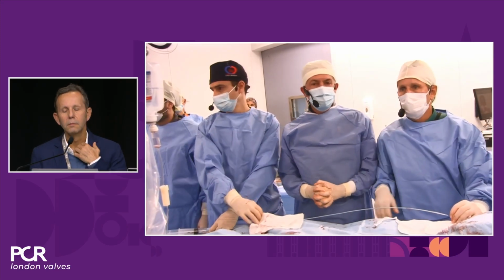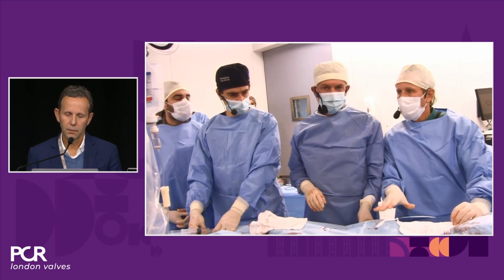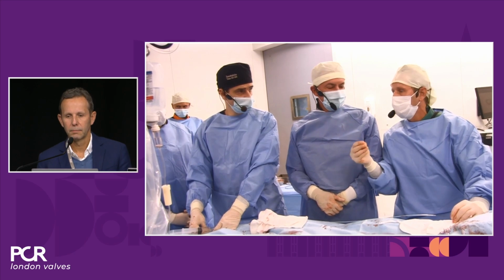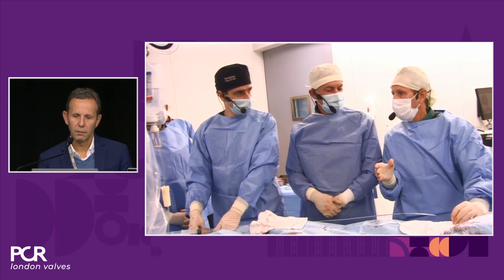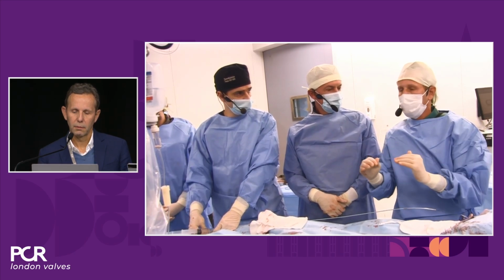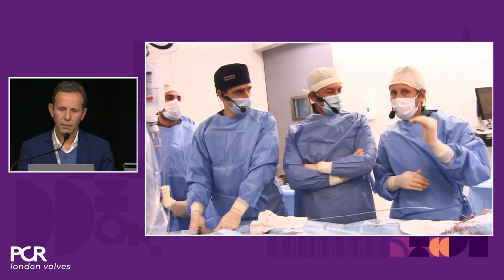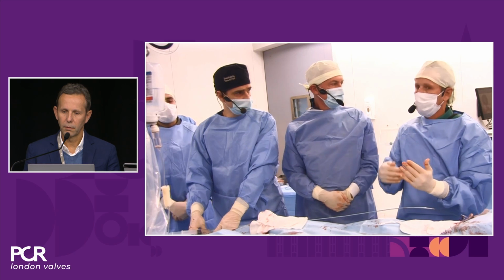So Fabio, according to the zero contrast protocol, how do you select the valve type and valve sizing? Okay, for the valve type, we always choose a self-expandable valve because it's a little bit more forgiving with regard to sizing. And also, of course, you can reposition if needed. That's very important in this kind of technique. For the sizing, we rely on the non-contrast CT and mostly the size of the sinus of Valsalva. We can measure it very well with the non-contrast CT. And then we choose the largest valve that we can accommodate inside that annulus. For example, for this case, the sinus of Valsalva is 28, and the largest valve that we can accommodate there, the largest Evolut, is a 26.